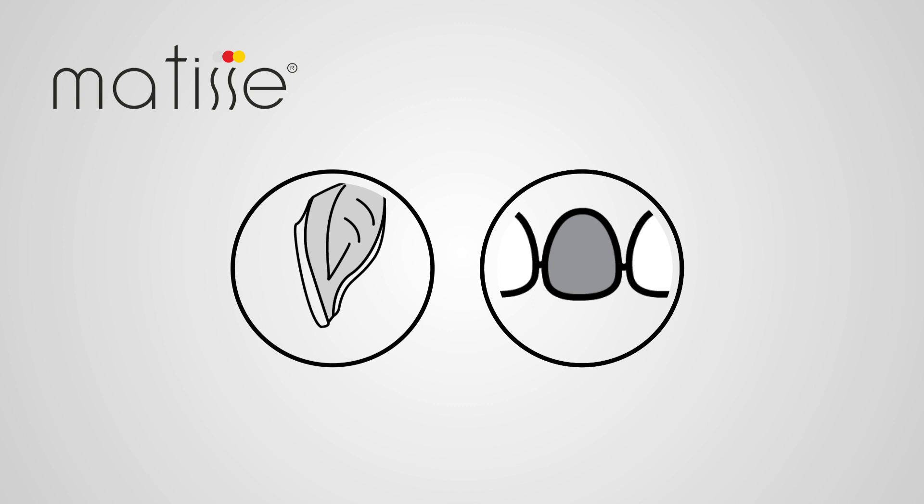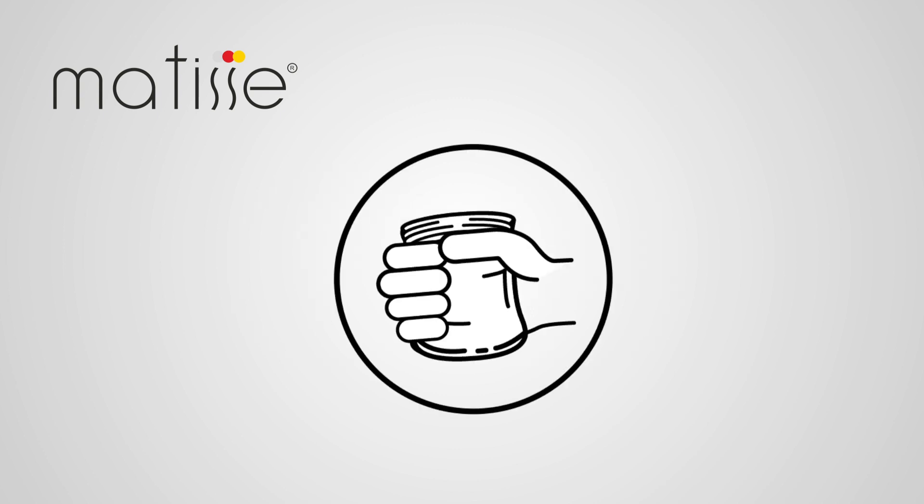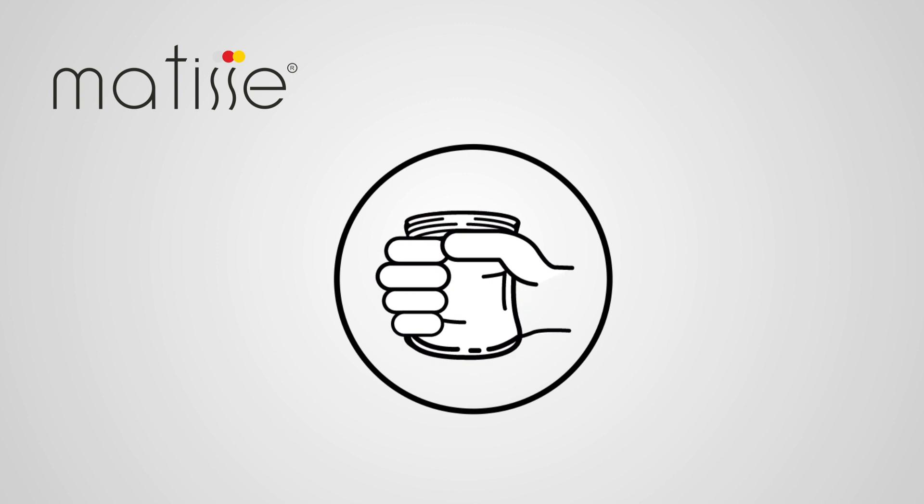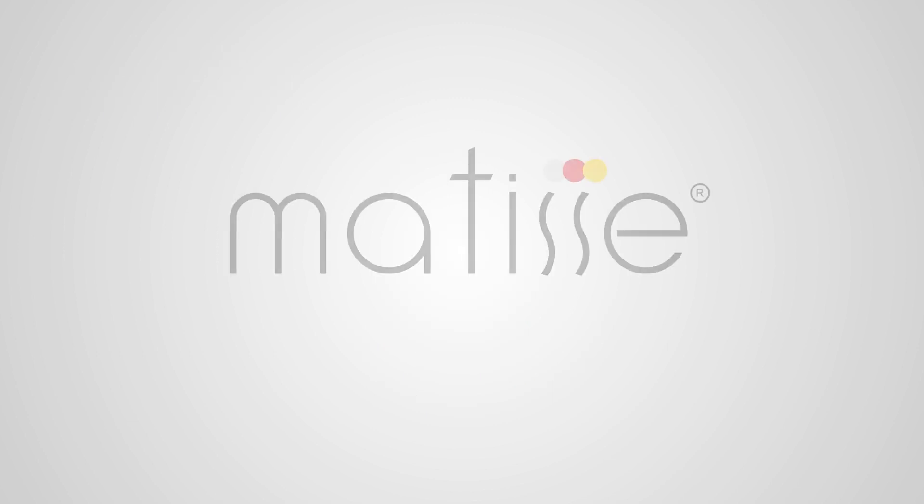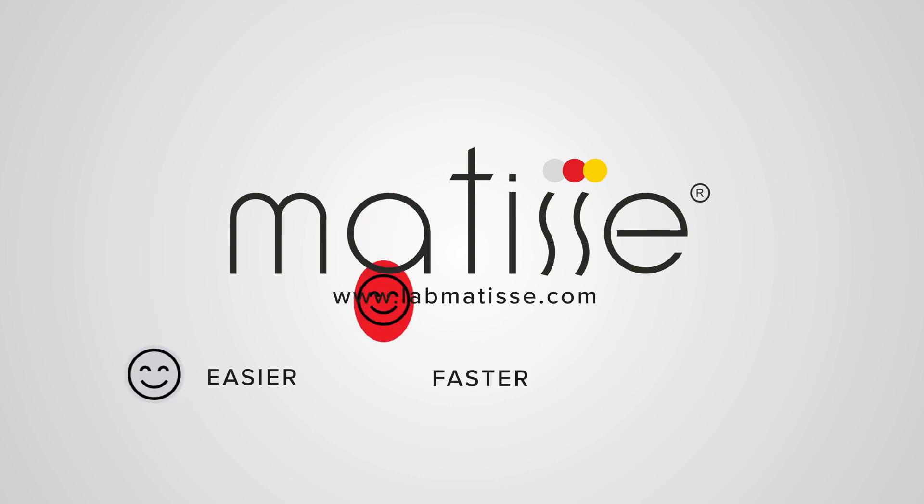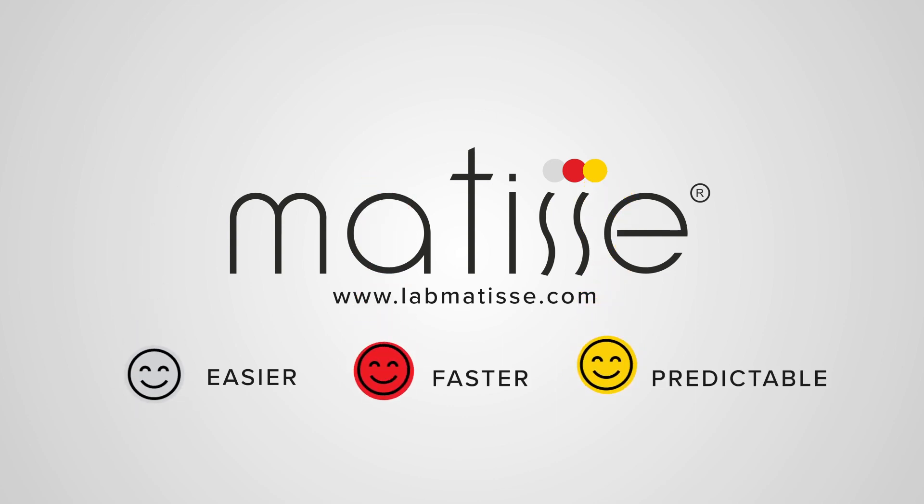Indication of the correct skin enamel masking recipe for veneer on refractory. When you get the ceramic recipes, just mix them in an empty bottle and start layering. Join Matisse and achieve a shade match easier, faster, and more predictable.